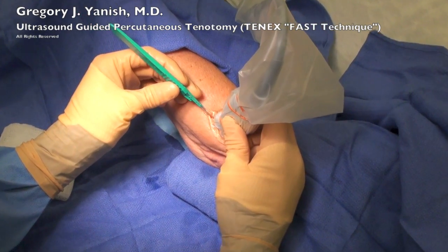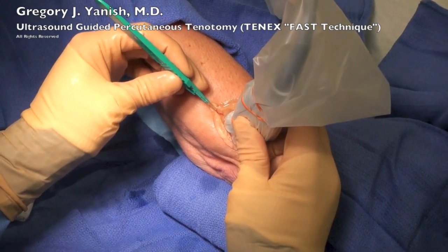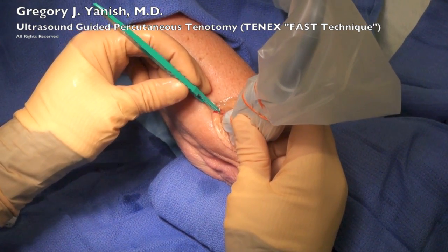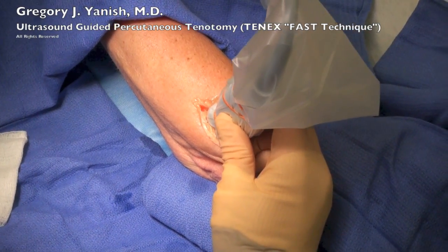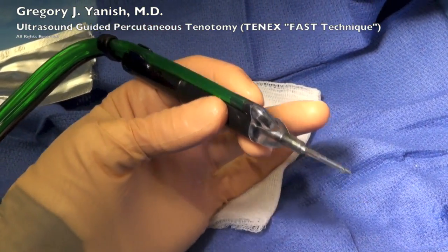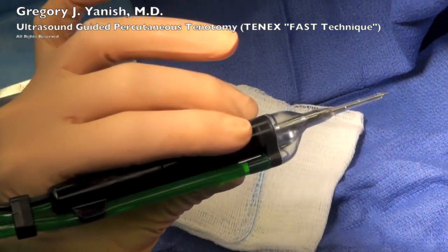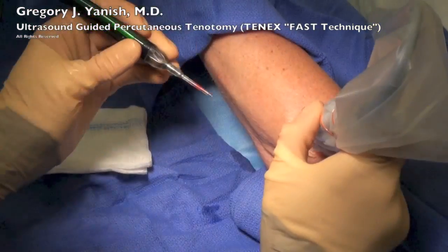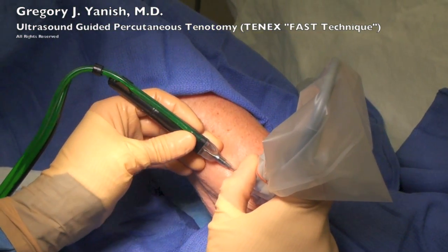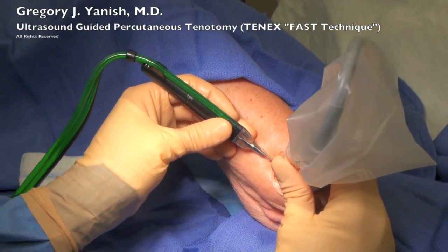At this point, I'm using an 11-blade scalpel to make a tiny little opening that the instrument will go into the arm. This is like a paper cut and is extremely minimal. This area is already under local anesthetic and is not painful. This is the TX-1 handpiece that I'll be using. It has a micro tip that actually performs the work of the surgery, cutting and debriding the dead or injured portion of the common extensor origin tendon.